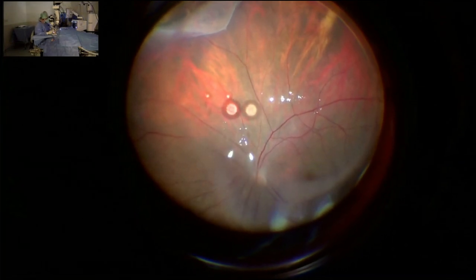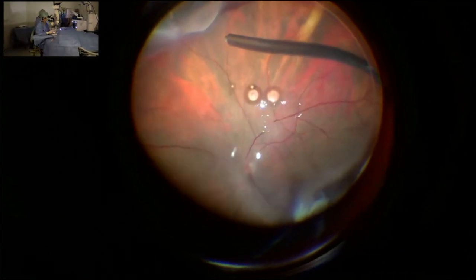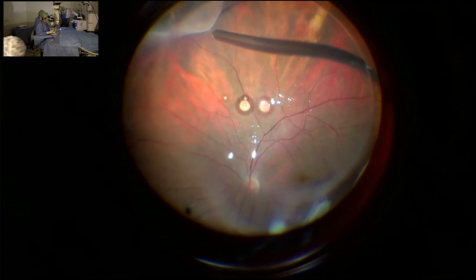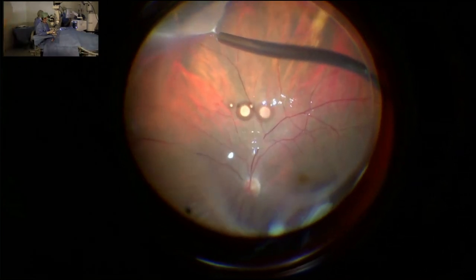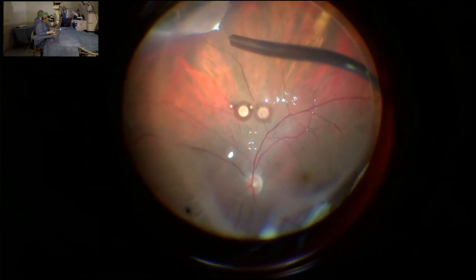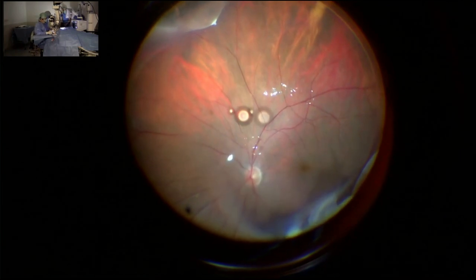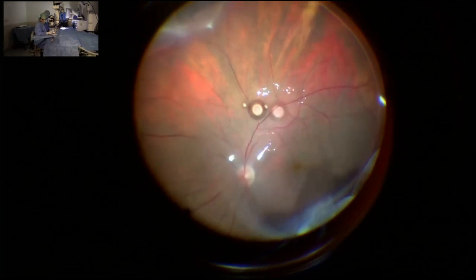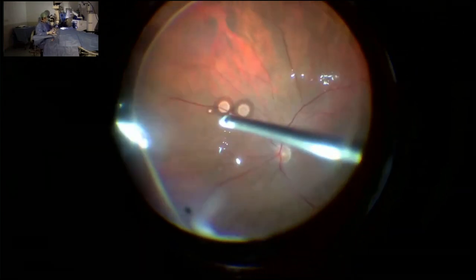Usually in pseudophakic retinal detachment cases, we observe more than one retinal tear, and therefore it is better to mark it with diathermy during surgery to not forget it later on. So there's a small retinal tear there. I will put a mark with diathermy, then I will do laser at the end of surgery.